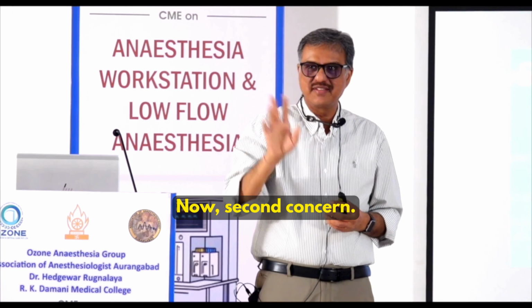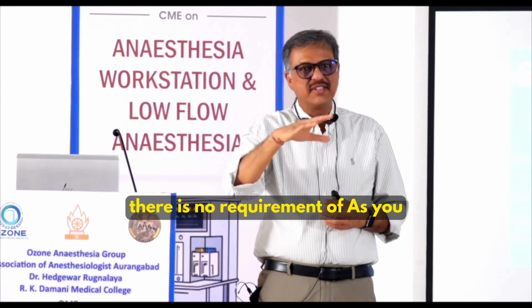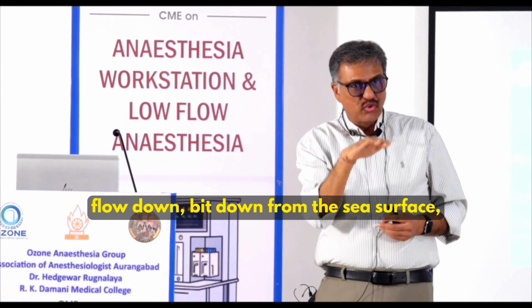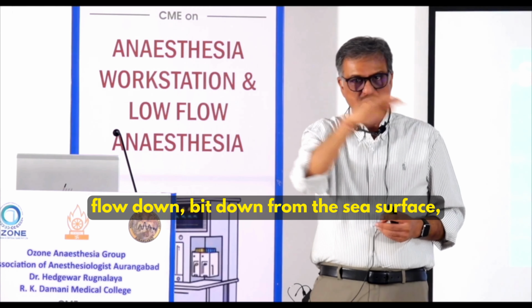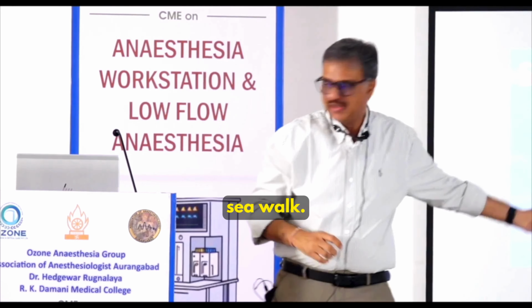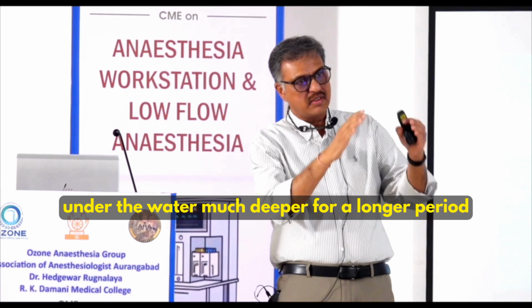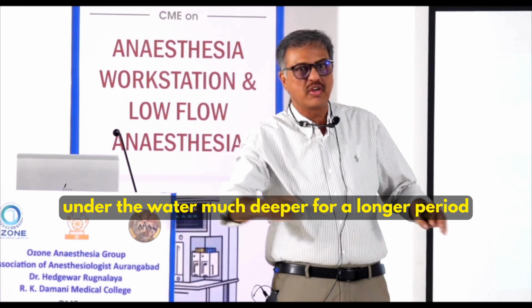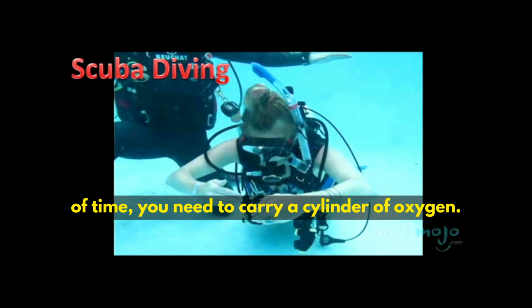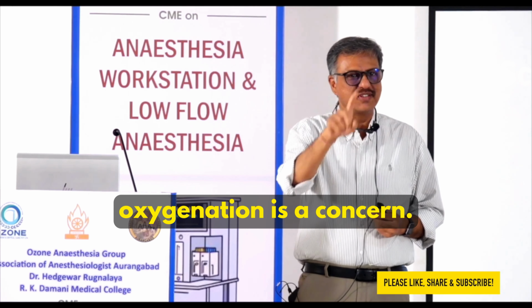Now, second concern. As you are flowing on the surface, the oxygen requirement is not that much. As you go down a bit from the sea surface, you need to carry an oxygen hood during a sea walk, and if you remain under the water much deeper for a longer period of time, you have to carry a cylinder of oxygen. In the same way, in a low flow anesthesia, oxygenation is a concern.